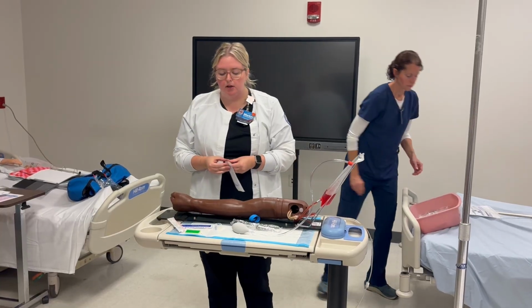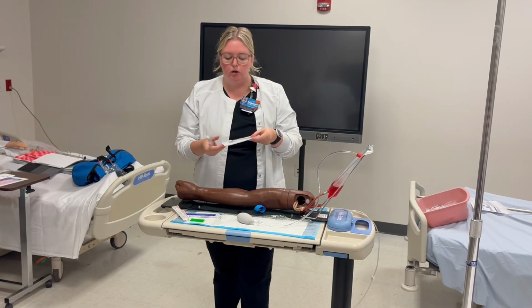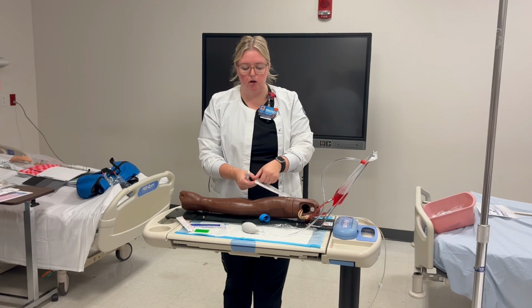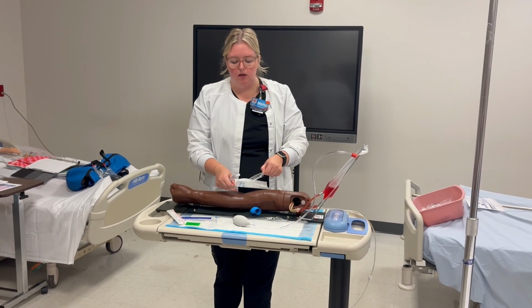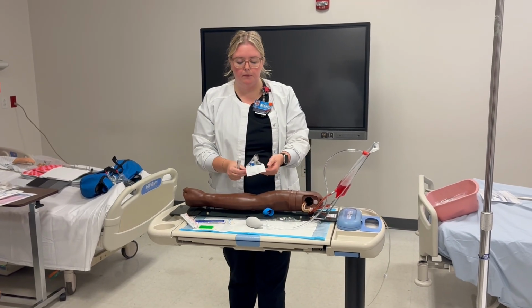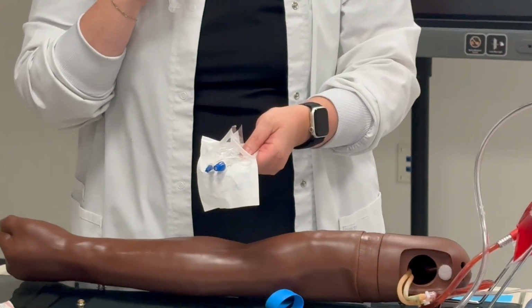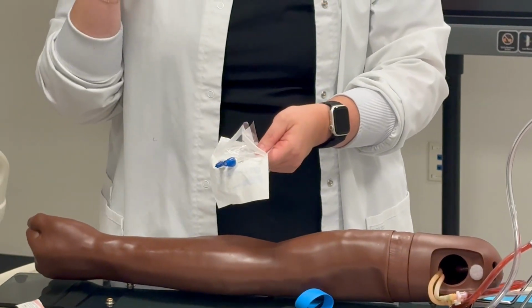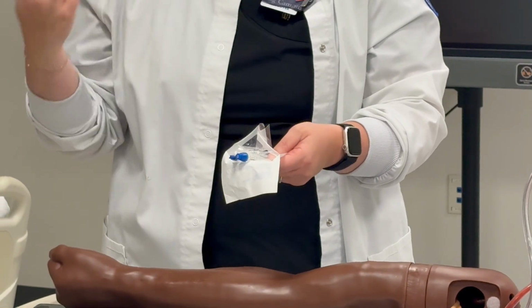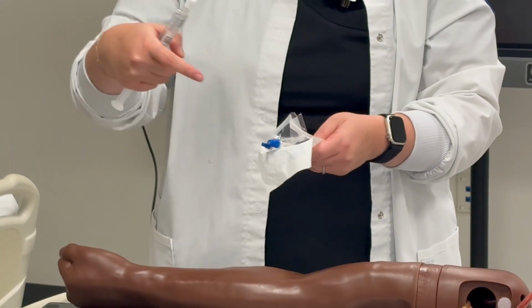So this part's extremely important, so pay close attention. When you open your J-loop package, do not completely pull it apart. You want to open it. Now, inside here is sterile, right? Sterile, clean. So medication is going to flow through this tubing into the patient, right? So if I start touching this, it's contaminated, which means bacteria, even if I have gloves on. Gloves sit in the rooms, they're clean, but they aren't sterile. If I start touching this, when I attach something to it, I'm telling that bacteria, hey, flow through here and into the patient.